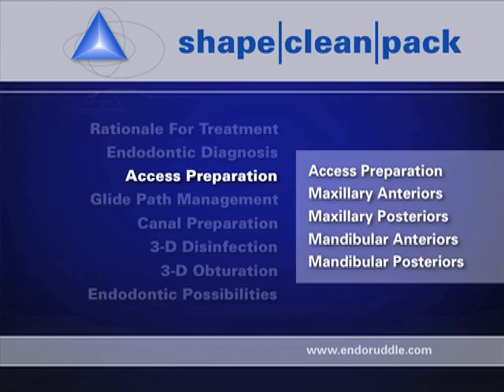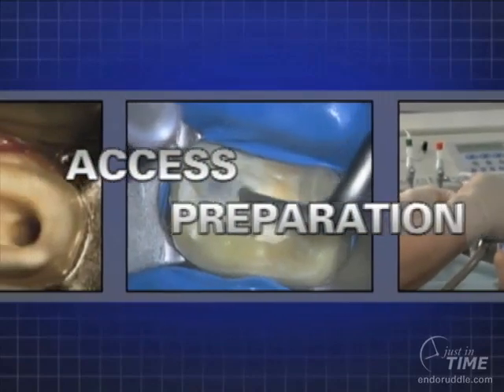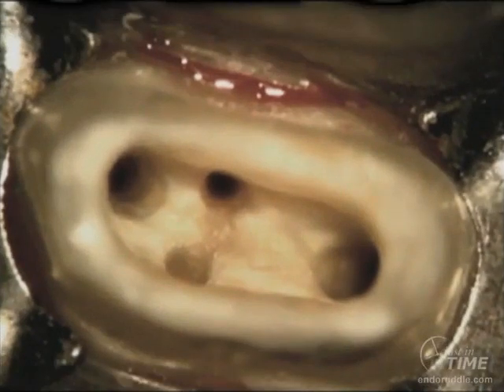Let's get started. I've often said that perhaps the most important thing we as endodontic educators do is when we teach access preparation. The size of the access cavity is not a universal agreement. In fact, you tell me where you went to dental school and I'll tell you how big you were trained to make your preparation window. But if we think about general dentistry, it's quite interesting to borrow some of those concepts that have been so useful over the last 100 years.